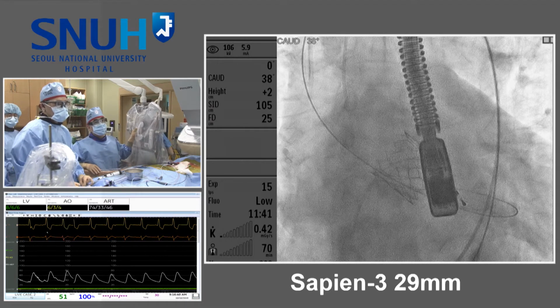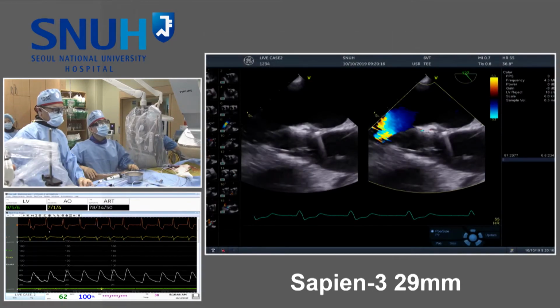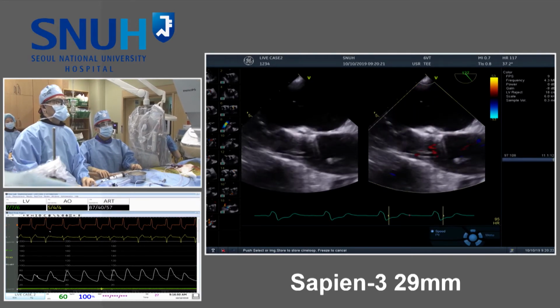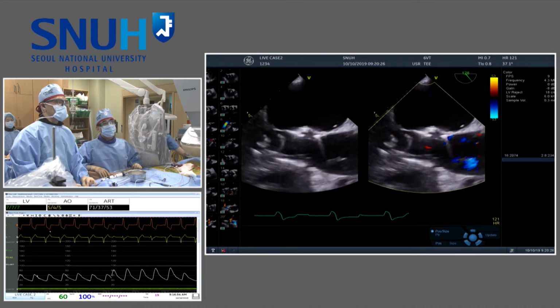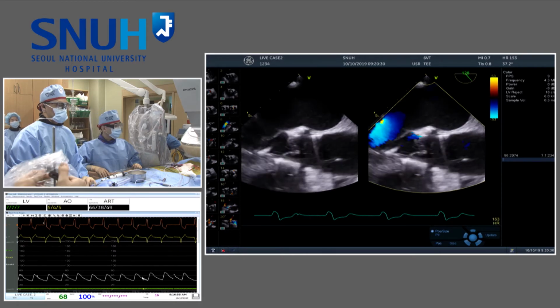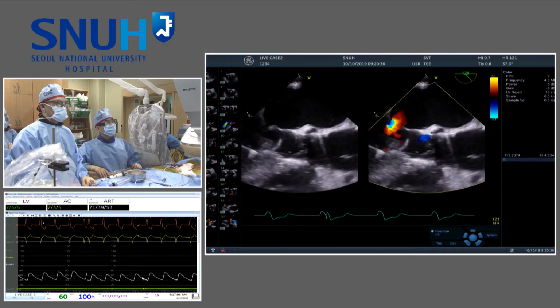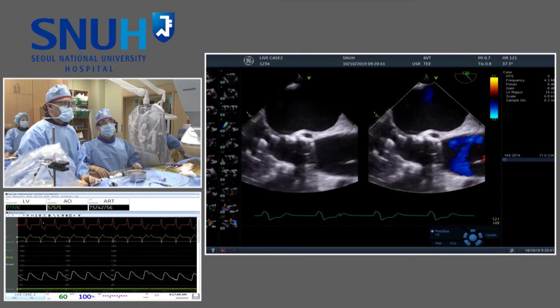You know, it's a very weird phenomenon. I don't know if you all notice it. The recovery of the blood pressure after the implantation of Edwards takes much more time than the self-expandable. Even if you are rapid pacing while implanting the self-expandable, the recovery takes more time with the Edwards. I don't know why. Not too much, okay, but it takes more time.